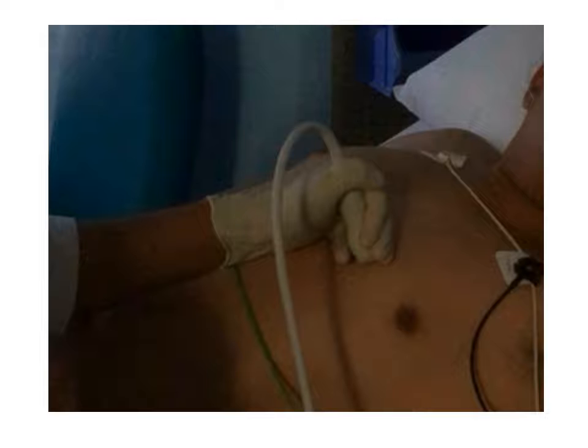Patients don't seem to mind it. What it tends to do is spread the pressure that you are exerting on patients onto a broader area, and they don't feel the discomfort. They don't feel as if you're poking the transducer or the echo probe into their chest. But also you should notice, and I apologize, it's not being projected very well in the photograph, that your wrist and your elbow should be in the same line.